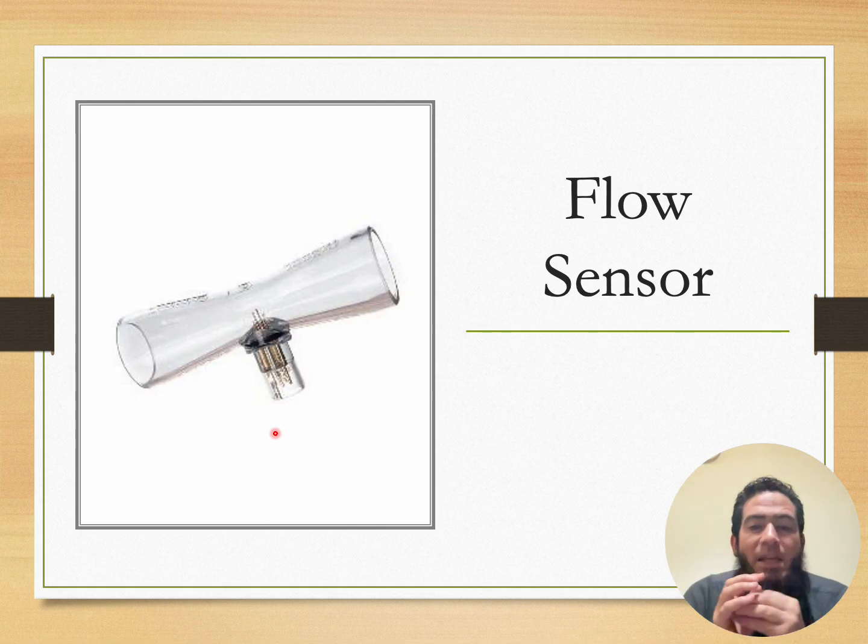so if the trigger mechanism is not working, that means all the modes that have any interaction with the patient will not work. It will work only as mandatory. So the assist control will be only mandatory, and the SIMV will be only mandatory, and actually the CPAP will not work if you are putting your patient on BiPAP, for example, on the mechanical ventilation.